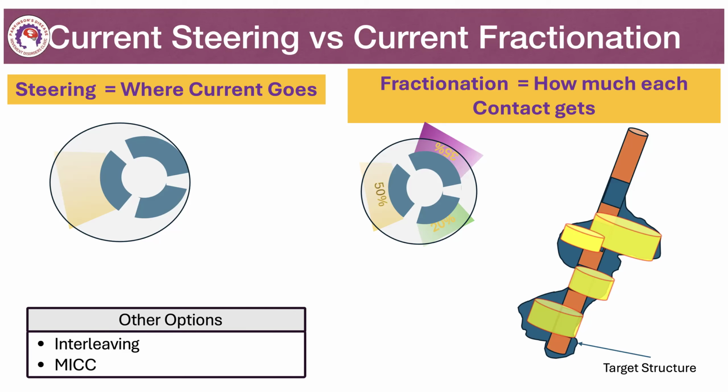Other concepts are interleaving and other things. Interleaving is from before directionality came into the picture. I'm not going to touch a lot on it because the previous speakers have spoken about that.